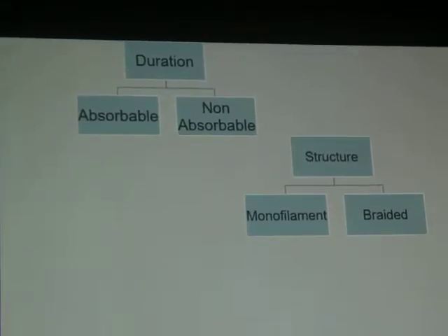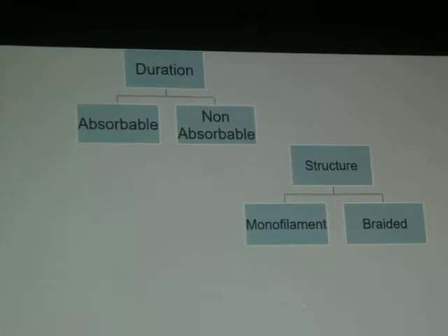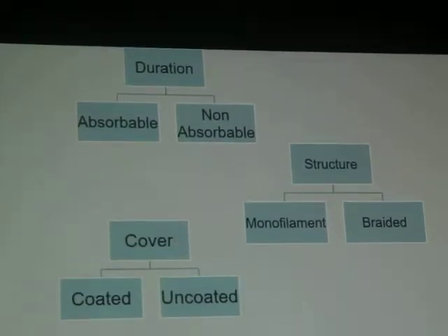So it can be absorbable, non-absorbable, monofilament or braided, can be covered.